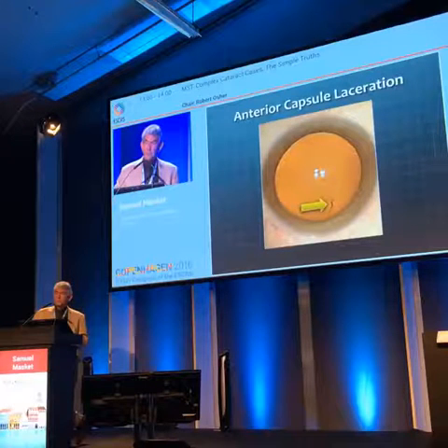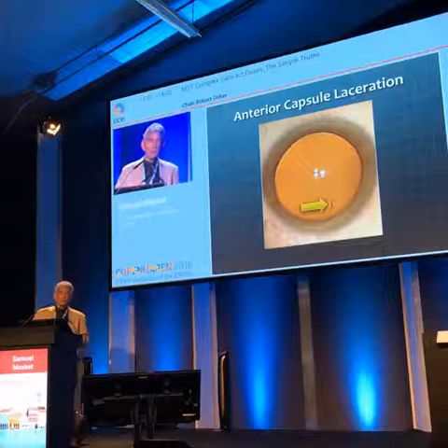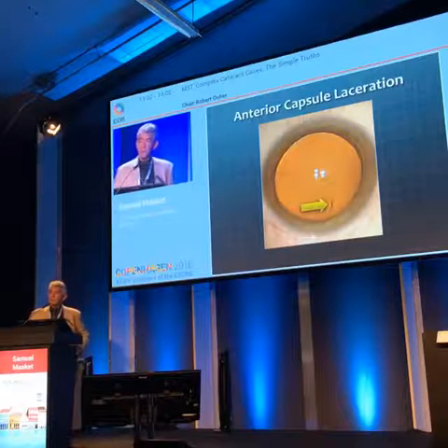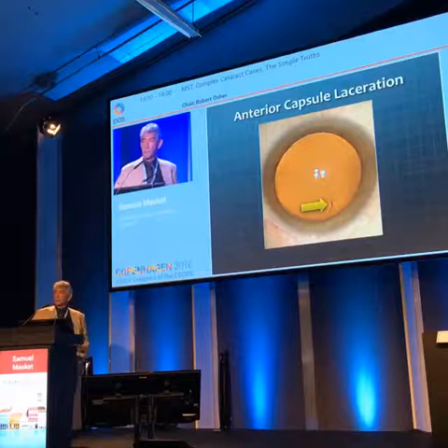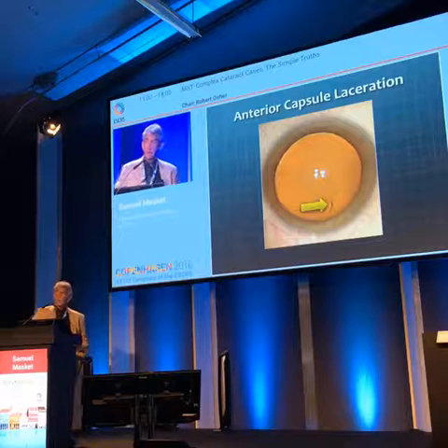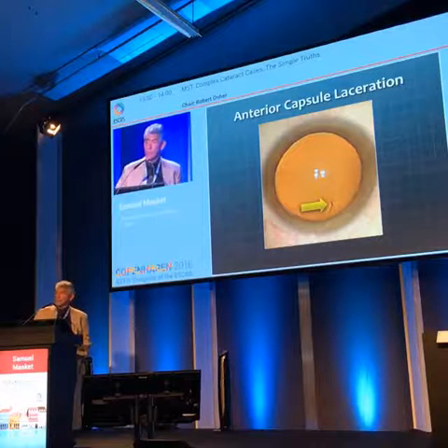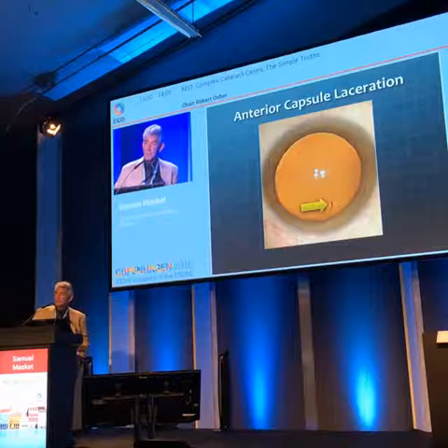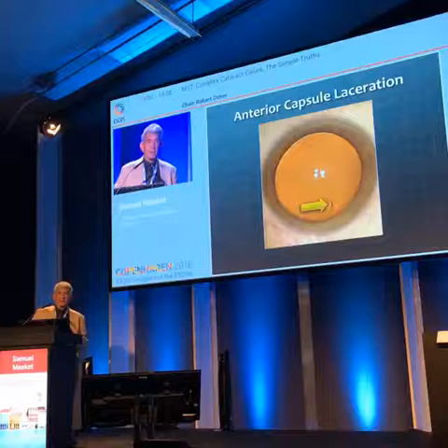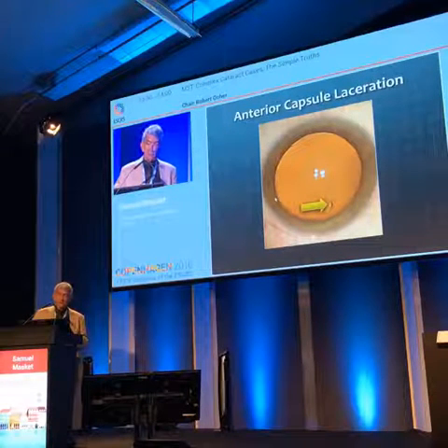This is a patient, this is a challenge. An hour before I saw this patient, she was a very happy woman. She was being treated for recurrent submacular choroidal neovascular membrane, with repeated anti-VEGF injections that retained good central acuity. However, this particular morning, after the retinal surgeon injected the medication into the vitreous, intraocular pressure was elevated. You put a 30-gauge needle at the limbus to lower the intraocular pressure.